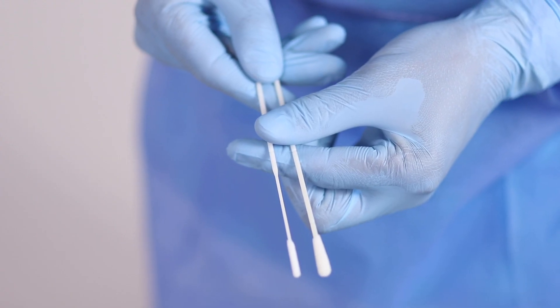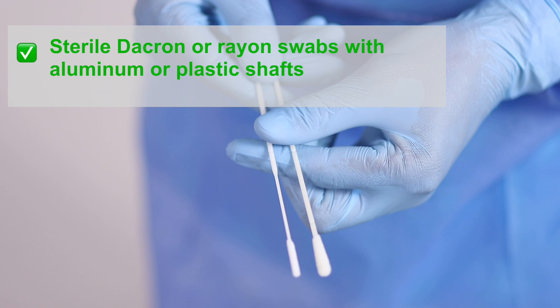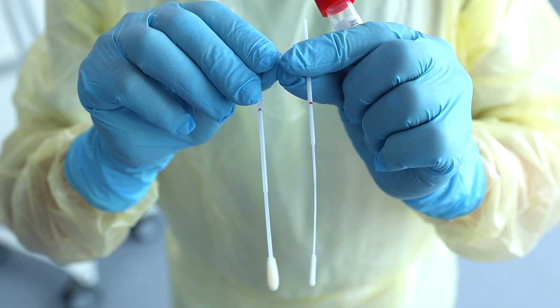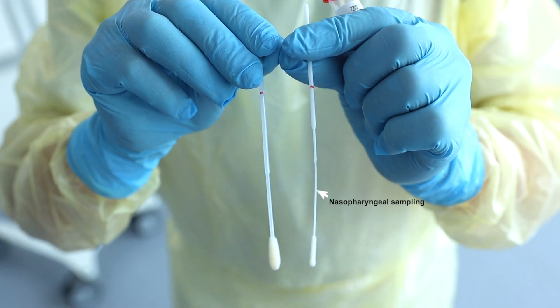The type of swab used is very important. Only sterile Dacron or rayon swabs with aluminum or plastic shafts should be used. This is because calcium alginate or cotton swabs, or swabs with wooden sticks, may contain substances that inactivate some viruses and inhibit PCR testing. Furthermore, flexible fine shaft swabs should be used for nasopharyngeal sampling. When sampling the throat, swabs with a rigid shaft are preferred.